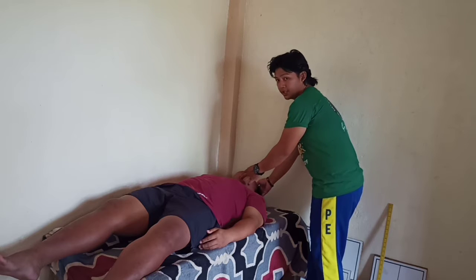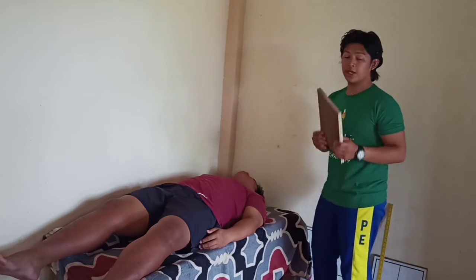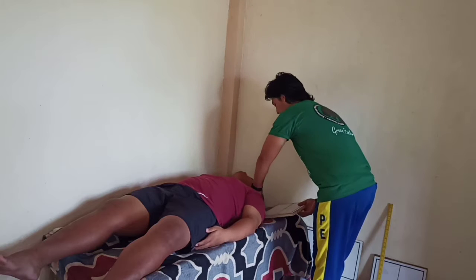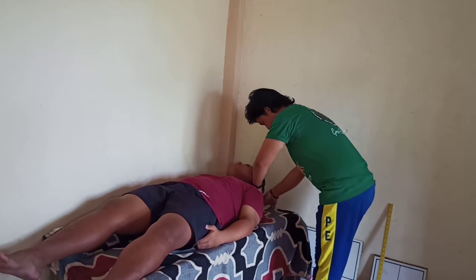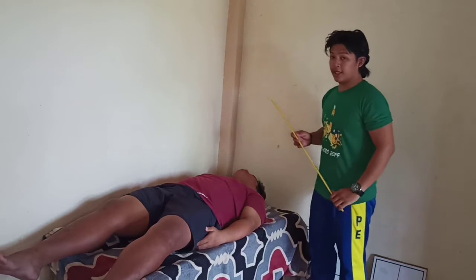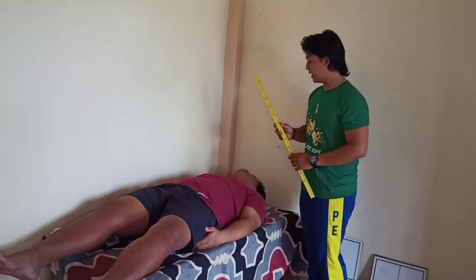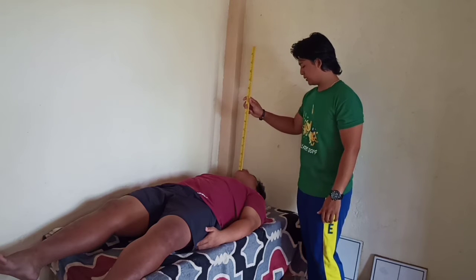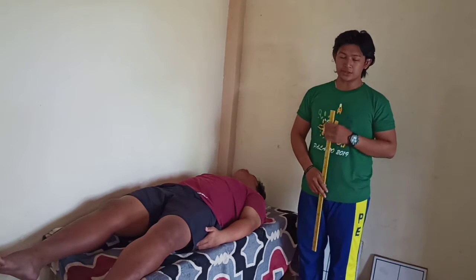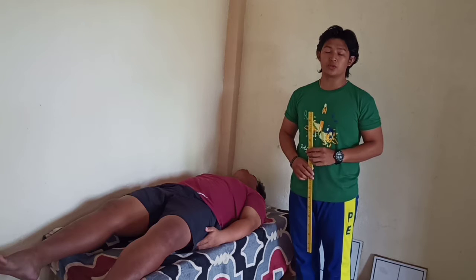and mastoid process until they form vertical. And use 8x10 image receptor and center the image receptor at the tip of the chin. And the central ray must be perpendicular to the image receptor at distal tip of the chin. The structure shown in this projection is the dens of axis lying on the circular foramen magnum.